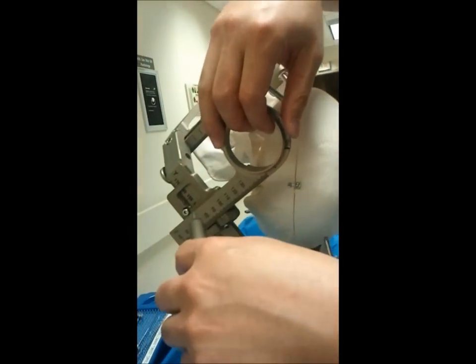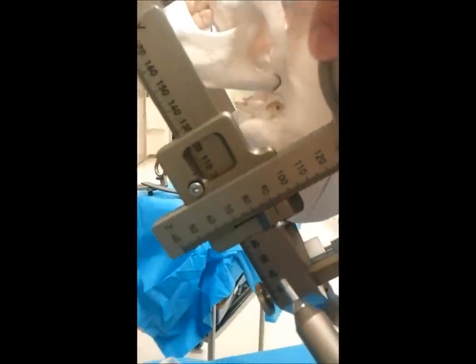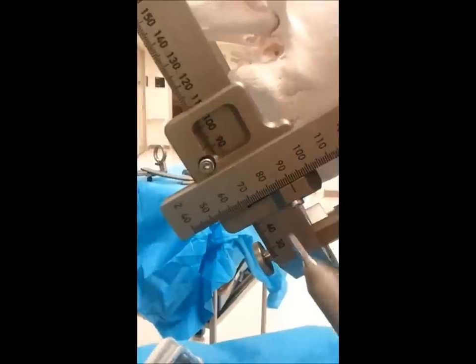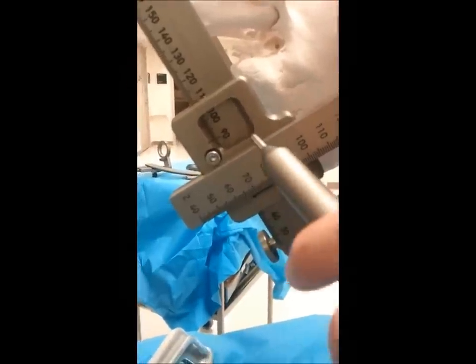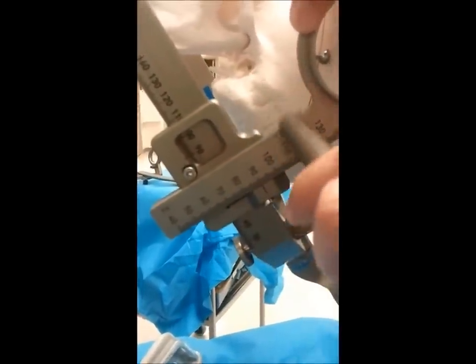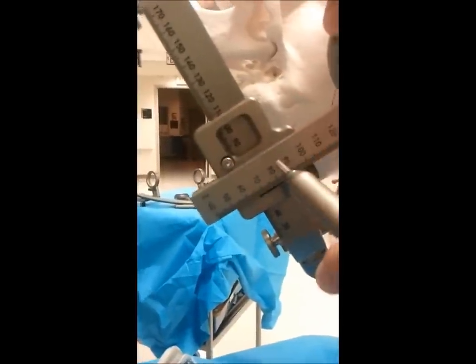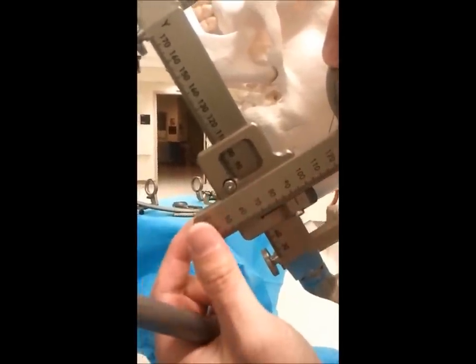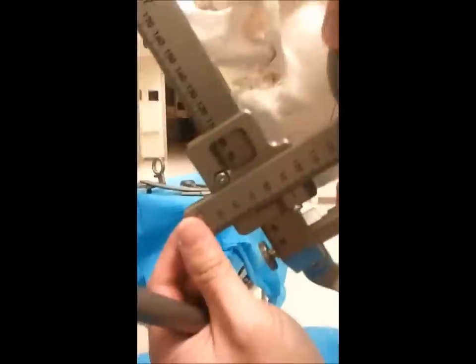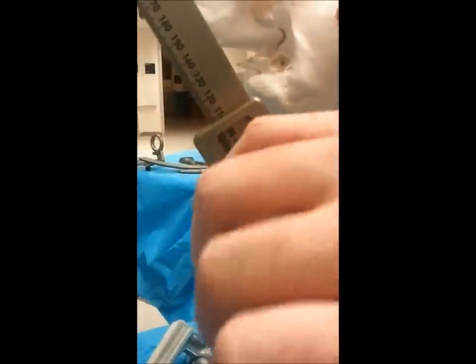Now we can set our AP coordinate, seeing that the numbers are up and in the appropriate position, and we can target for 90. The other trick is sometimes if it's stuck you can tap it — but if using a sterile screwdriver, you want to be away from the non-sterile portion, so tapping down at the bottom would not be ideal. The other physician who has a non-sterile hand can grab it from the bottom, and that will not contaminate anything.